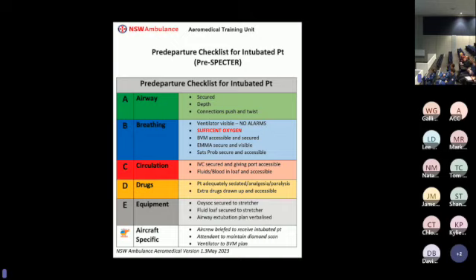Probably one thing we should have put there is that the circuit from the Oxy Sock runs into the sleeping bag and up to the mouth, and that's just to reduce the amount of movement that you may get on the circuit itself. This has got a larger surface area. So into the sleeping bag, up to the connection at the ET tube, and everything's push twisted. Circulation, IV fluids are secured, and we've got that loaf stowed away.